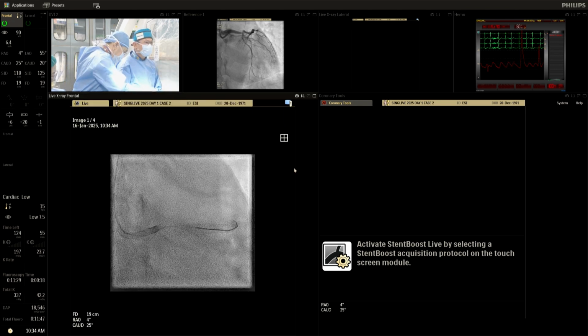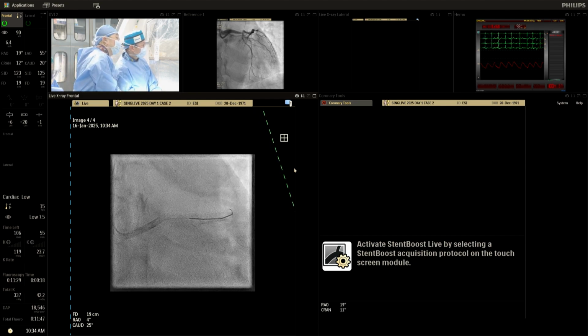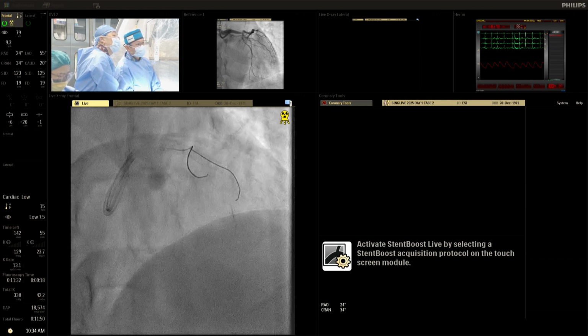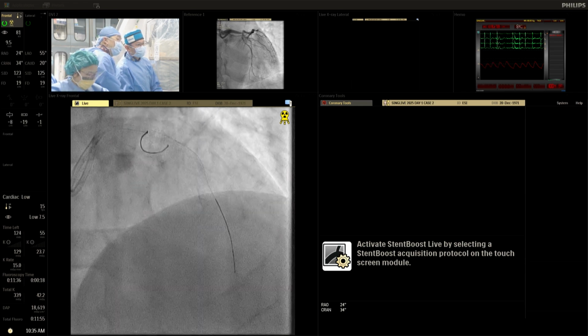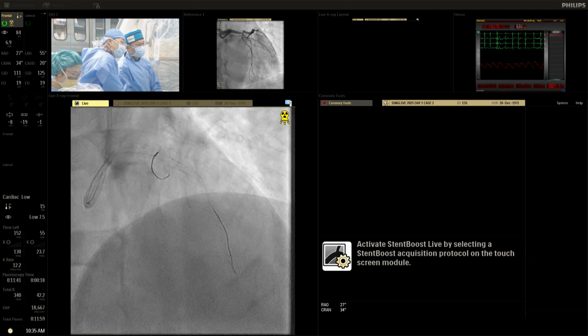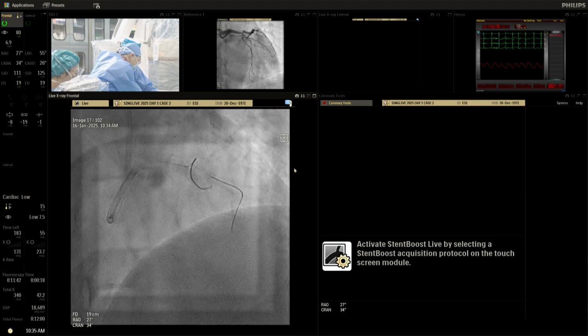Give me a cranial view, please. I need to move the wire. Okay, should be all right. So we're going to repeat the OCT again.